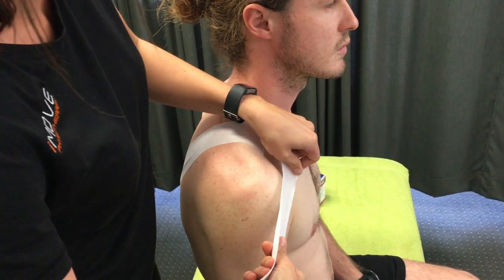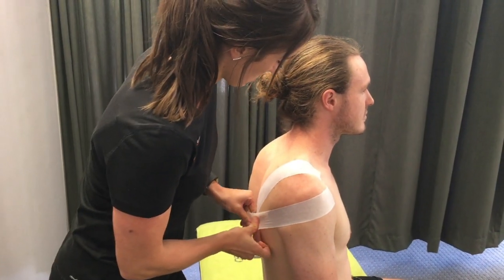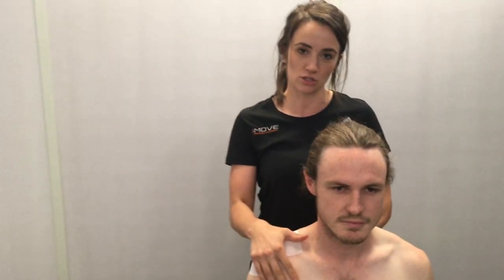I'm just going to have another piece coming around. So starting at the front, coming down and pulling through there. Give it a nice little rub through there and it'll just be nice to offload that area and position the shoulder.